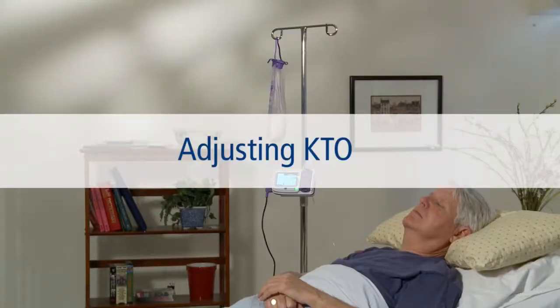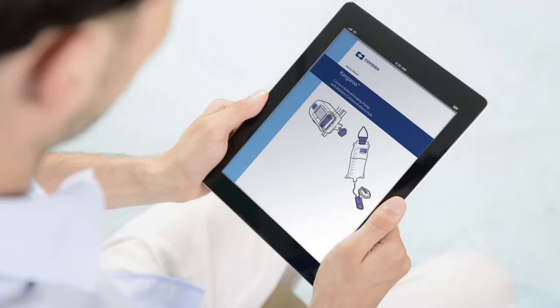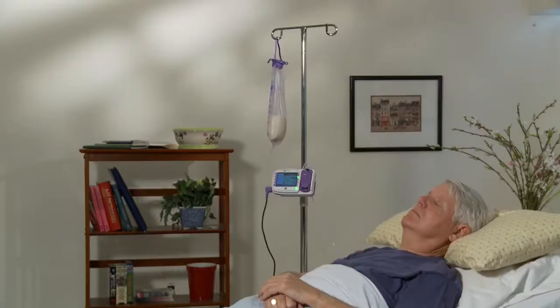Adjusting KTO. KTO is the Keep Tube Open feature for the pump. This feature allows you to temporarily pause operation of the pump while allowing a very small amount of formula to flow through the feeding set. See the operator's manual for exact amounts. The KTO screen will show a countdown until feeding resumes.